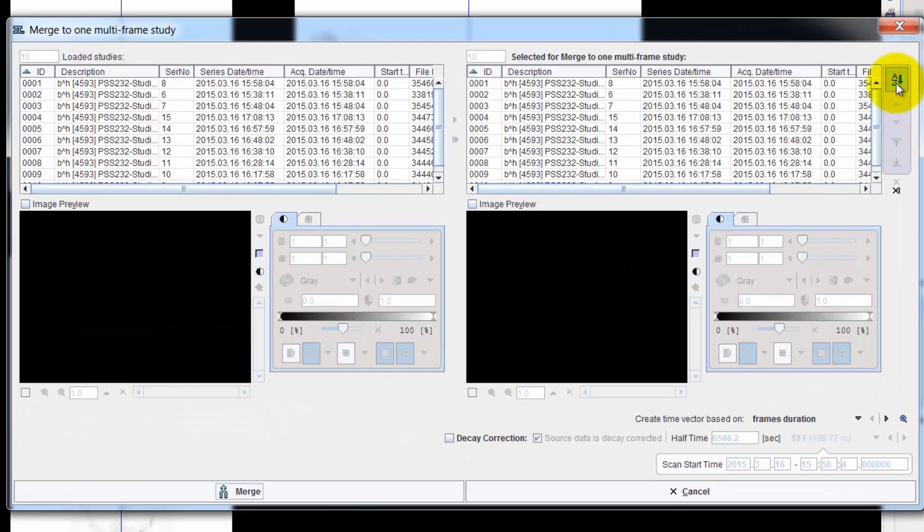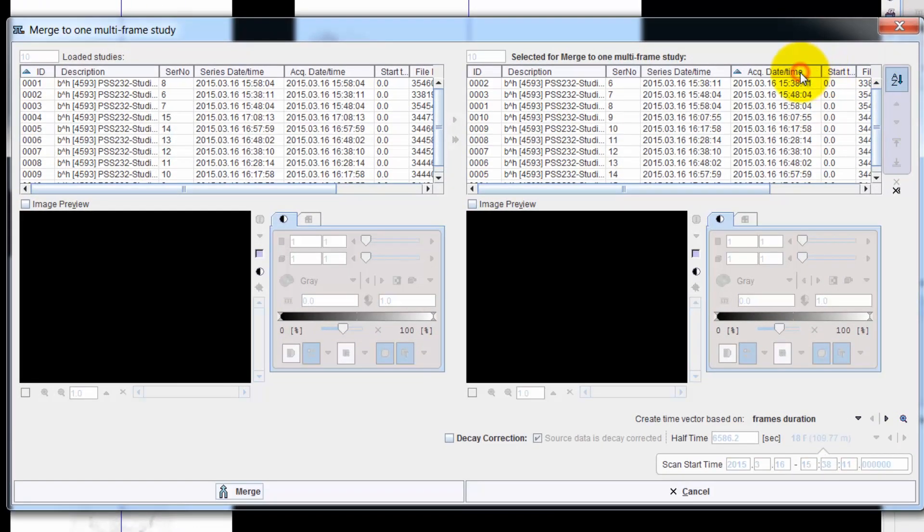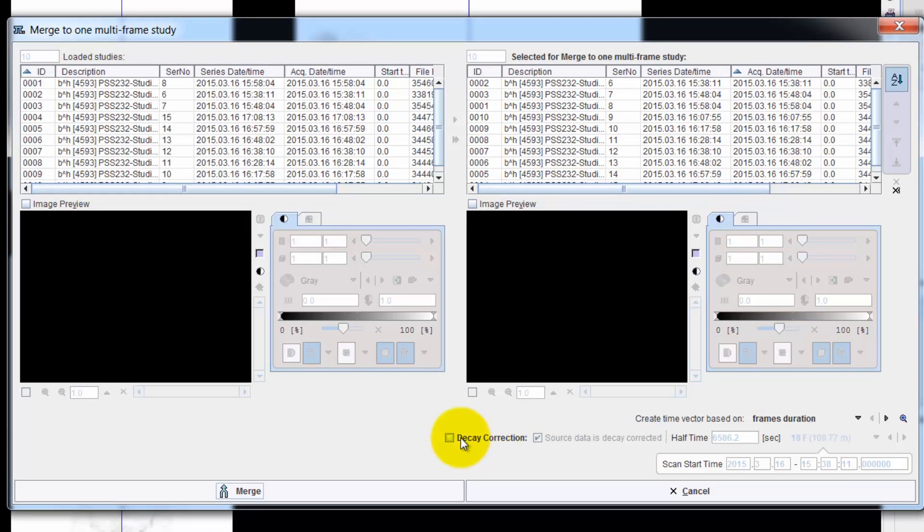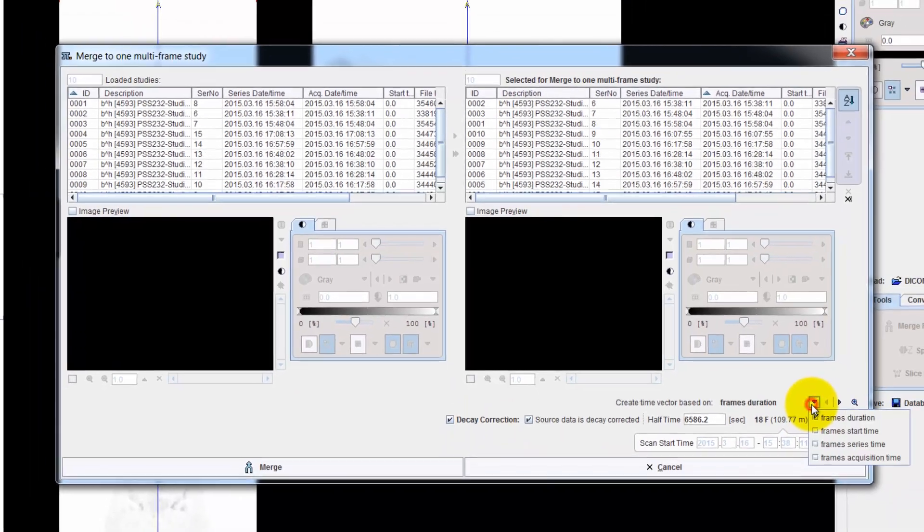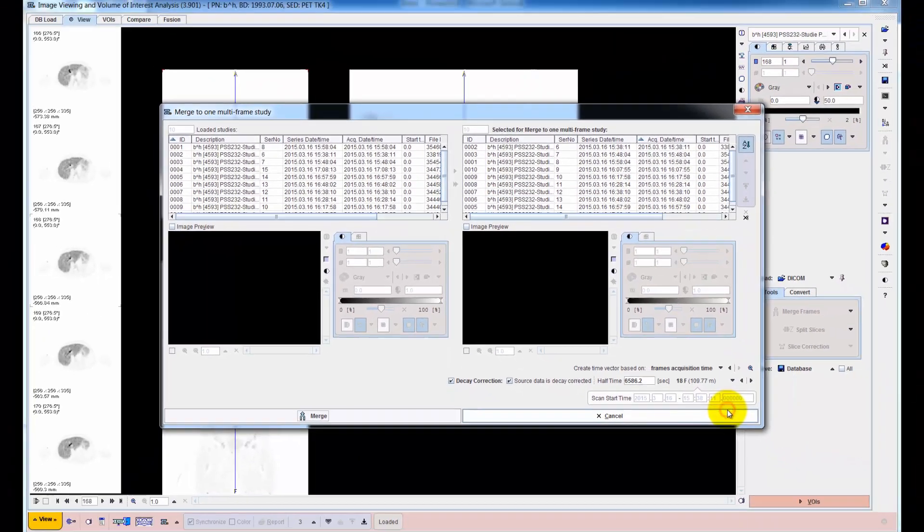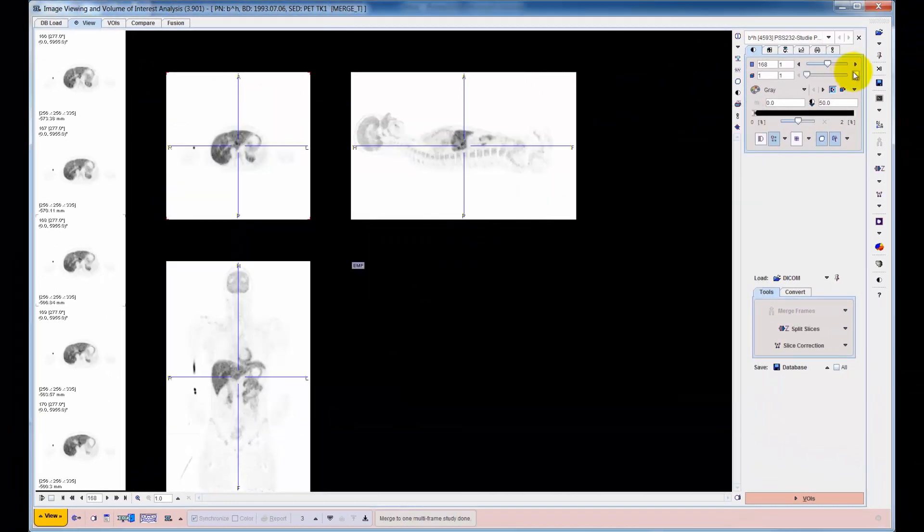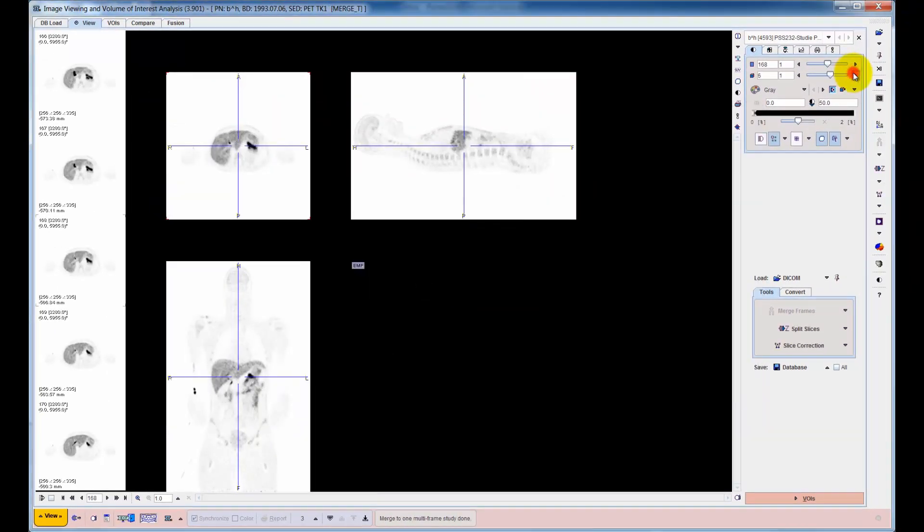First, the series are brought into chronological order by acquisition time sorting. Decay correction to a common time is enabled and a dynamic sequence is created.